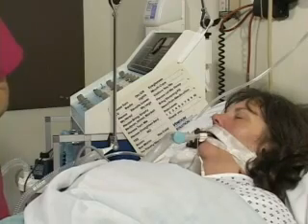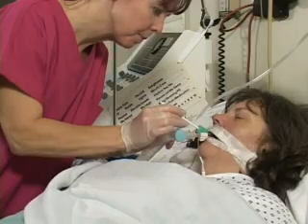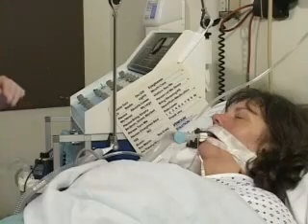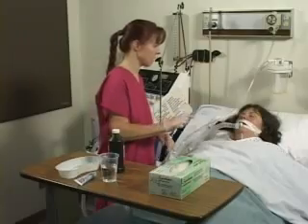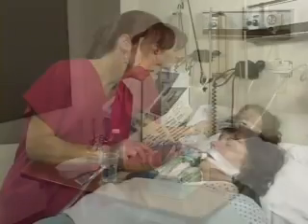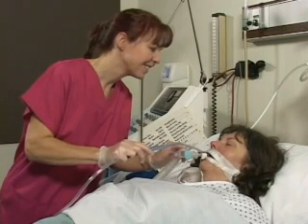When finished with the endotracheal suction, the rinsed catheter can then be used to suction the client's mouth before and after oral hygiene. Having an endotracheal tube can be uncomfortable. Oral hygiene is very important to the client's comfort. Wearing non-sterile gloves and using a soft or foam toothbrush and mild toothpaste is recommended. Use half-strength hydrogen peroxide and mouthwash mixed with water per your facility's protocol. Oral suctioning with an oral suction tip is used to remove dripped liquids from the oral cleaning procedure.